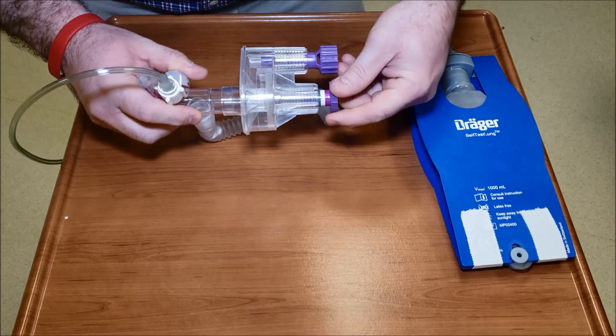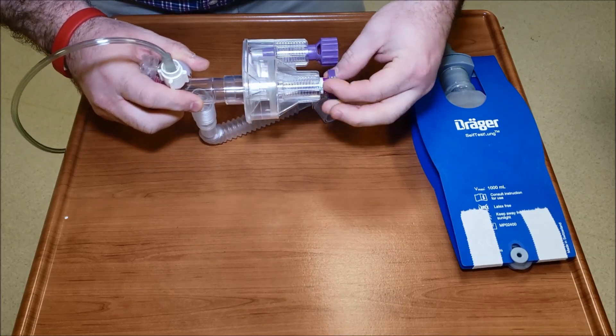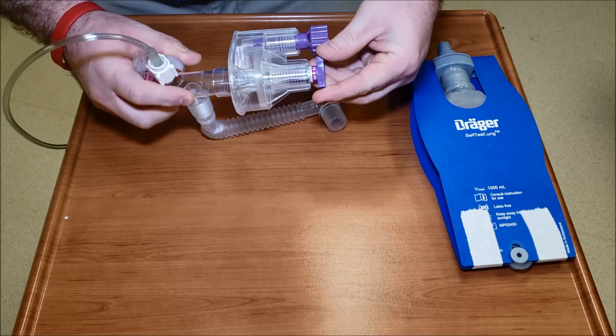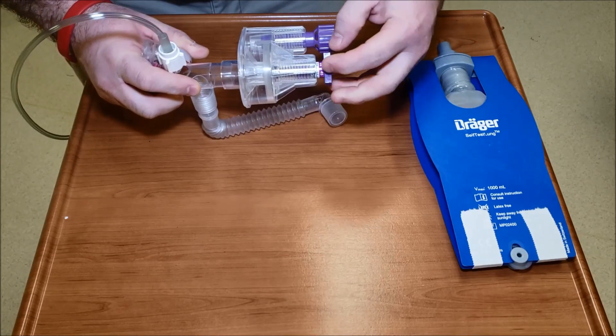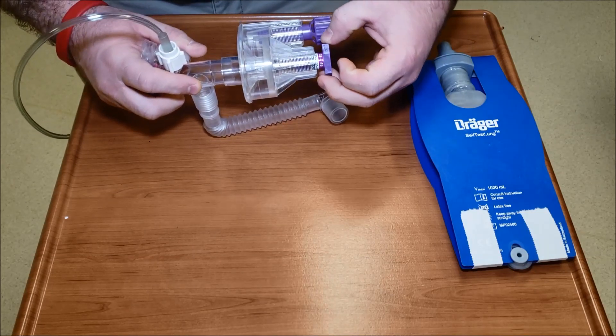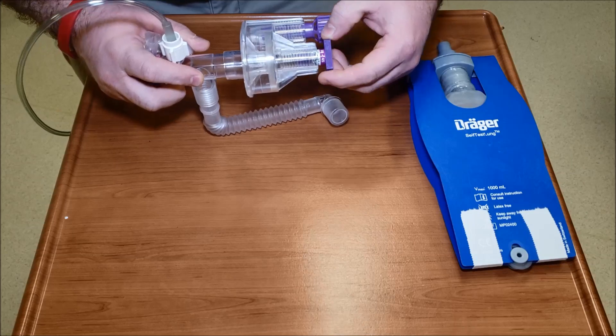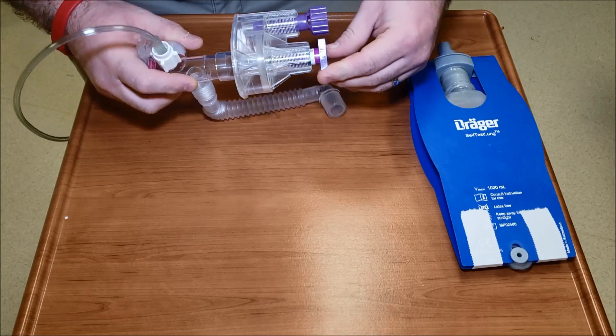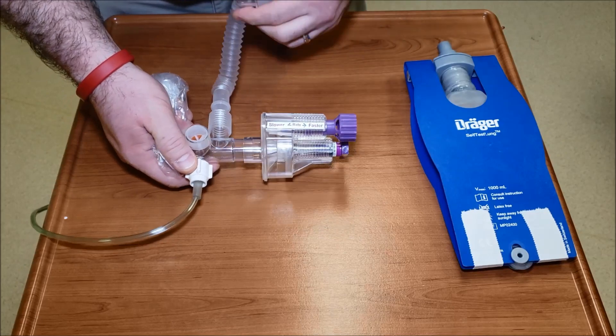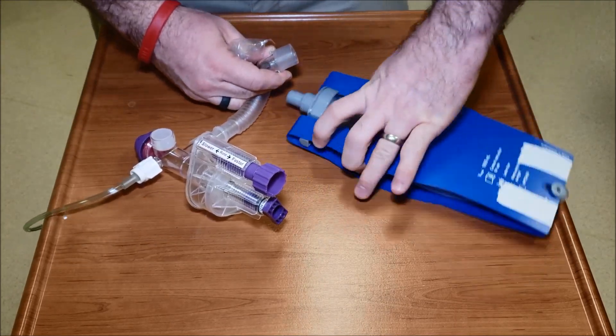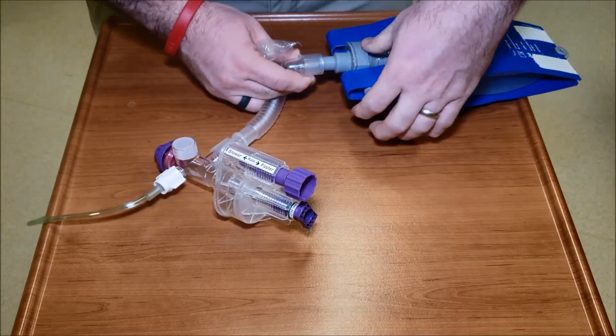As the instructions said, we're going to start about 25, so we're going to get it right to where it's pretty much set out of the box. The bottom of the line is 25 and the line between the purple and the white is near 35, so let's go right about there. Now I'm going to hook my test lung up.